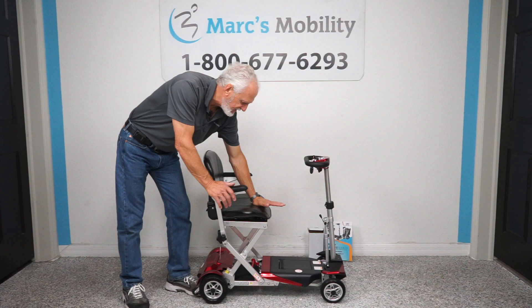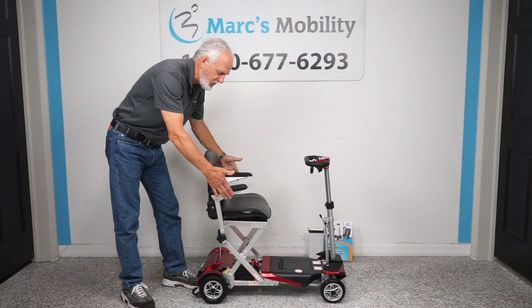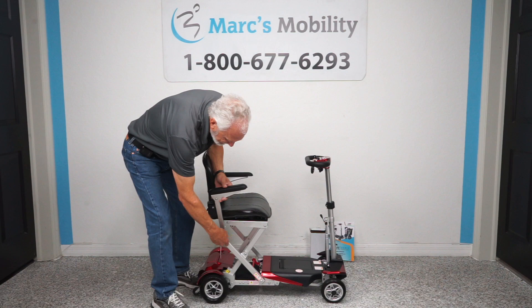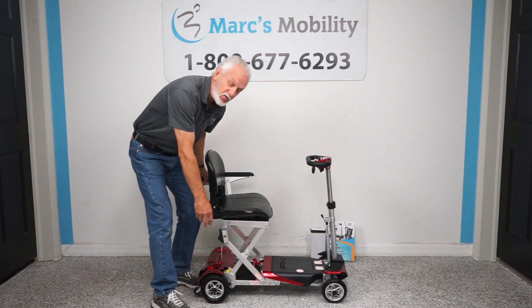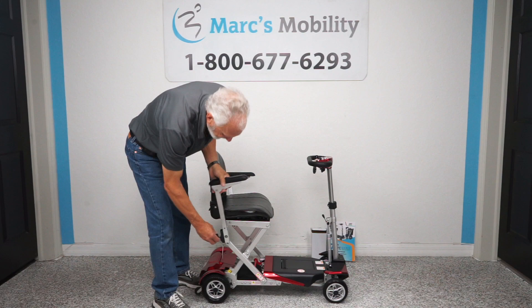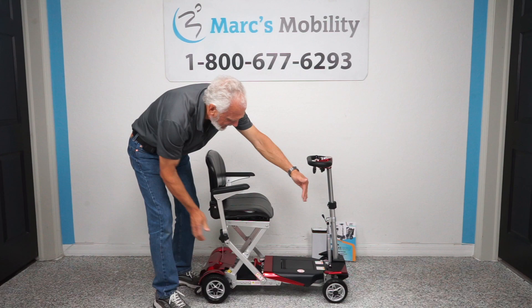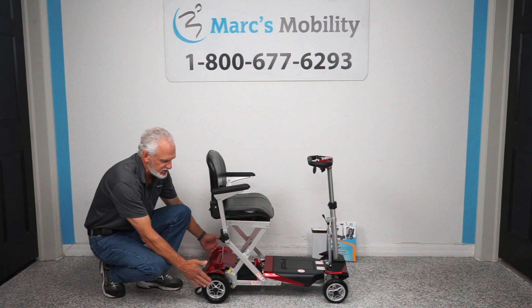You have arms that are removable. If you leave the arms, you're going to be at 24 inches from outside to outside of arm. If you take the arms off — just by removing this little knob right here — you can take the arm off and then the total width of your scooter is 22 inches. The length of the scooter from front to back is 38 inches.